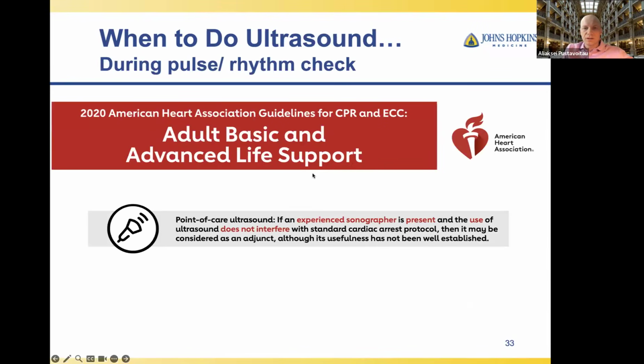The American Heart Association, in their adult basic and advanced life support, makes a statement about ultrasound. If an experienced sonographer, so someone has to be trained, is present, and the use of ultrasound does not interfere with standard cardiac arrest protocol, that's what we mentioned. You also not only need to have a person who knows how to use the ultrasound, you also need to make sure that all the resuscitative efforts are performed. And we'll talk a lot about it for the rest of the talk.